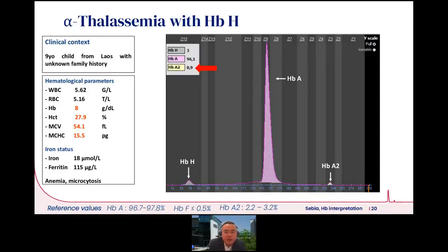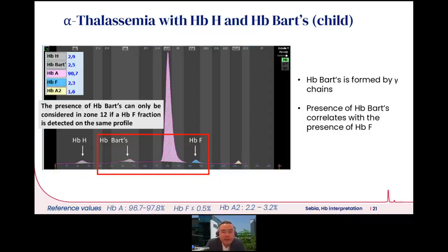When hemoglobin H is produced, it is visible in one of the zones of the capillary electrophoretogram, giving us visibility of alpha thalassemia. To confirm whether the hemoglobin Barts peak identified is reliable, it is important to correspond it to the expression of hemoglobin F. If hemoglobin F is not expressed, the hemoglobin Barts peak is most likely not reliable — always cross-check hemoglobin Barts expression against hemoglobin F expression.